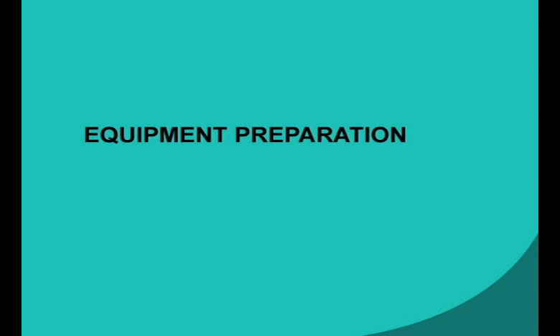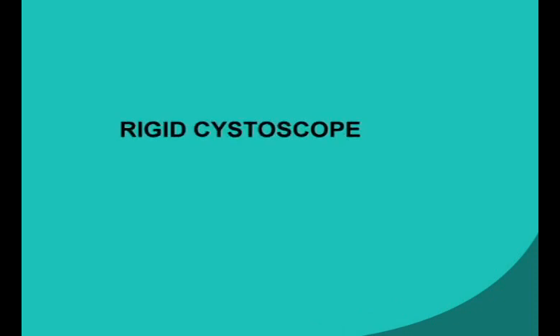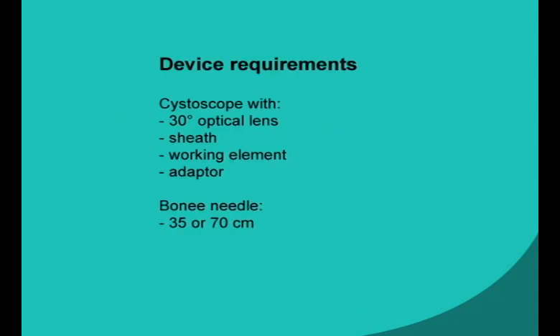Injecting medication into the bladder may be performed using either a rigid or a flexible cystoscope. For the demonstration with a rigid cystoscope, a 20 Charriere Storch cystoscope with a 30 degree optical lens will be used.